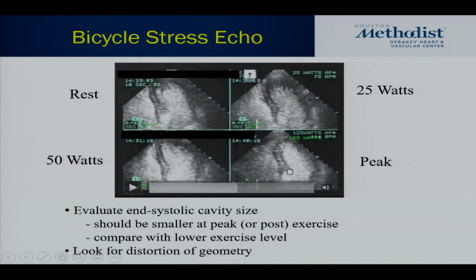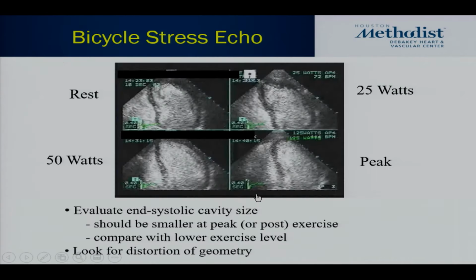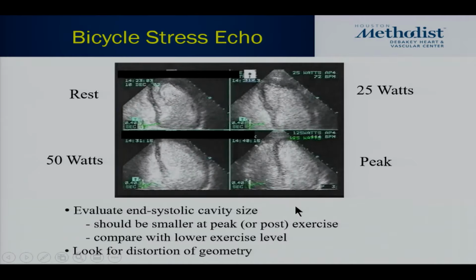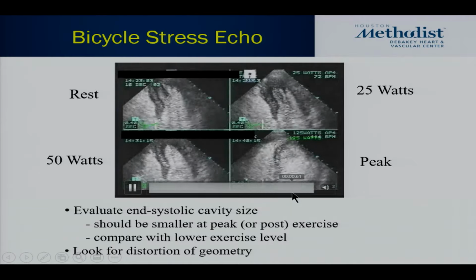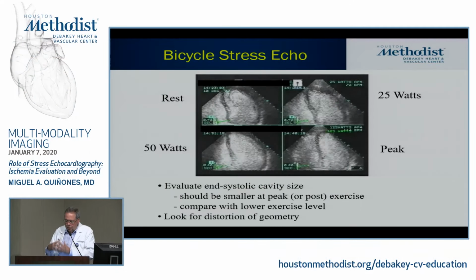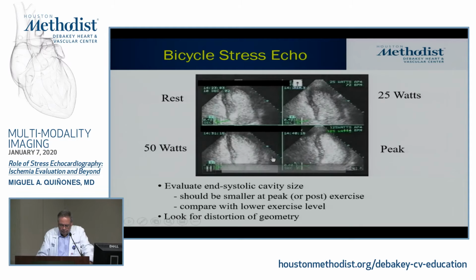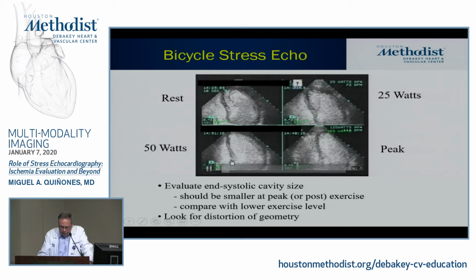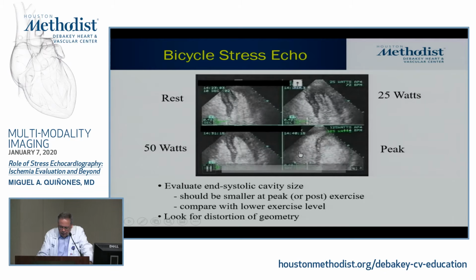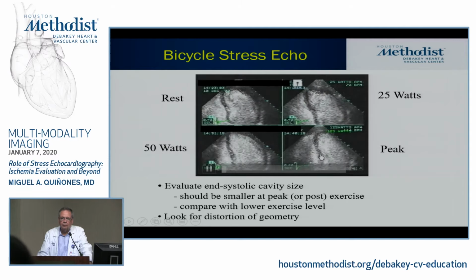So now, fine, great. We saw that. Now the question is, who's guilty? This guy or this guy? All right, let's go back. The arrow helped. All right. But watch it. Now that we have said, okay, there's something wrong here. This ain't normal, okay? And there's regional dilation at end systole. Now we focus more into your segments, okay? So now we have how much thickening we see here versus how much thickening we see here. And I agree, there's less thickening here.